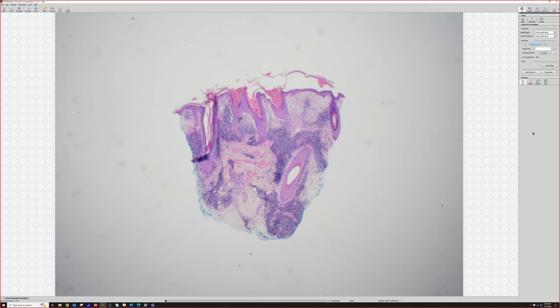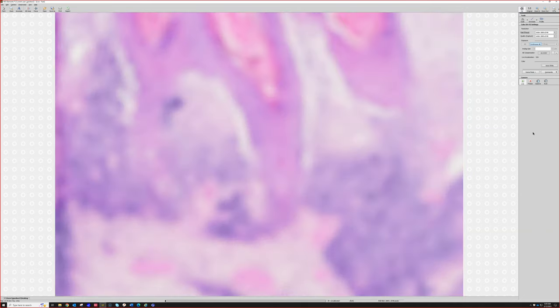I think discoid lupus is a good example of how vacuolar interface and lichenoid interface are both types of interface dermatitis that exist on a spectrum microscopically. In the books, we often teach them as different chapters. And it's true that some diseases are usually vacuolar and not lichenoid and vice versa. But in real life, they exist much more on a spectrum. I think you should keep an open mind that those two things overlap. That's my view. And then, like you said, the plugged, keratin-filled, dilated follicles are a great classic finding for discoid lupus in particular. Let's look closer.